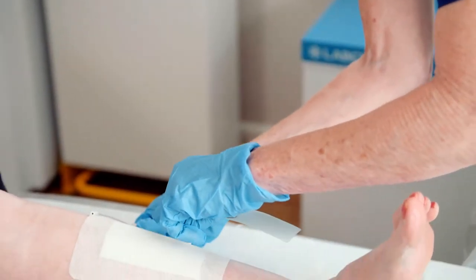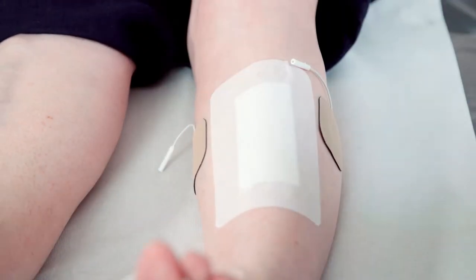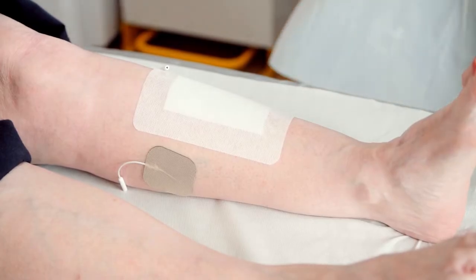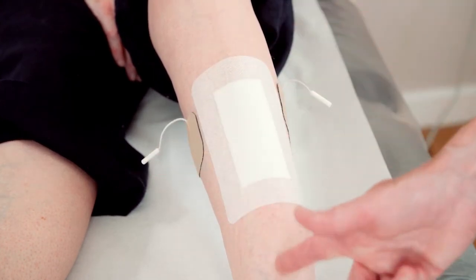Apply the Axel Heal pads as close as possible to the wound site on healthy skin either side of the wound, but ensure the pads are applied away from the area covered with the primary dressing. If the wound has excessive exudate, place the pads horizontally to avoid the pads becoming too wet from gravitational moisture.